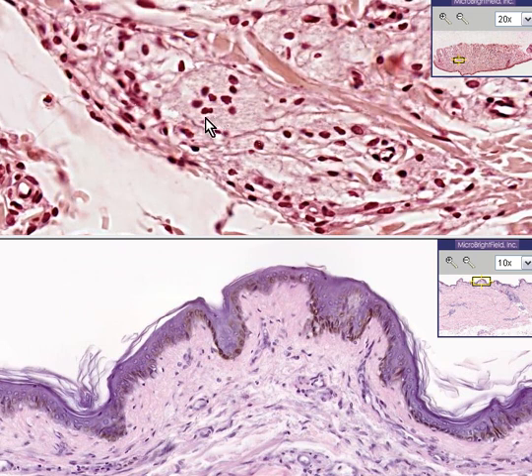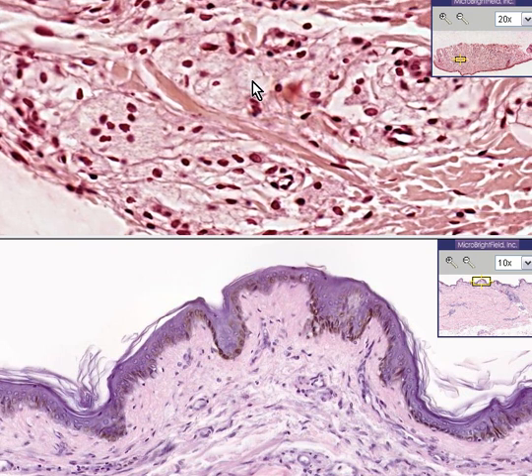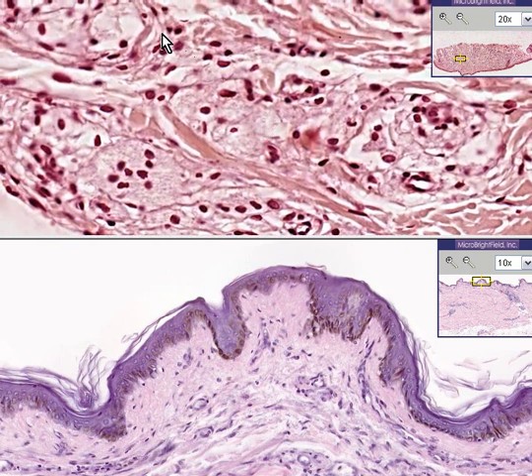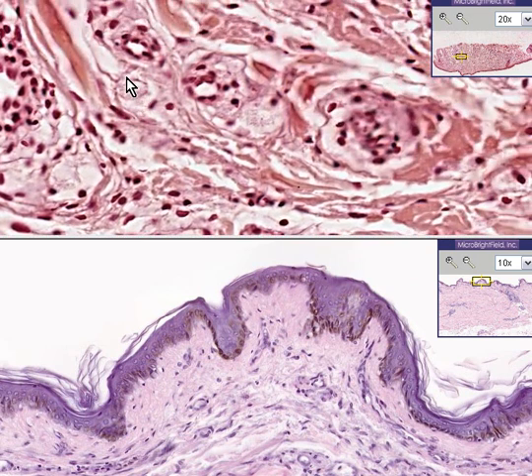In some areas, it almost looks like they are multinucleated, like here. All of these are xanthoma cells. Here's one, here's one, here's one, here's one, here's three or four. Prominent foamy cytoplasm filled with fat, cholesterol as well as other fats. I think cholesterol is the chief fat, though.